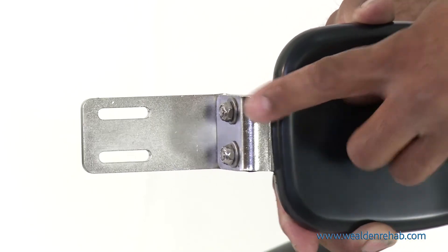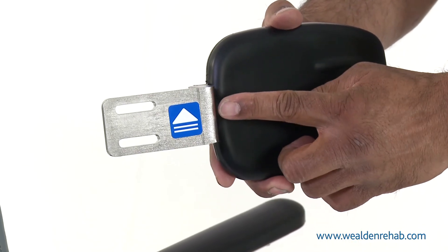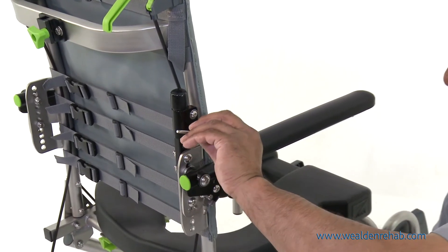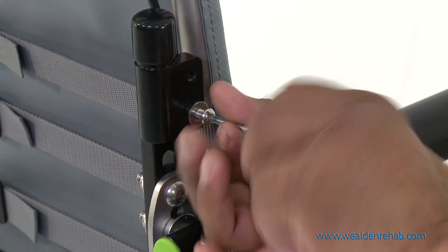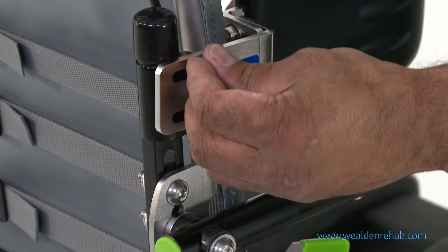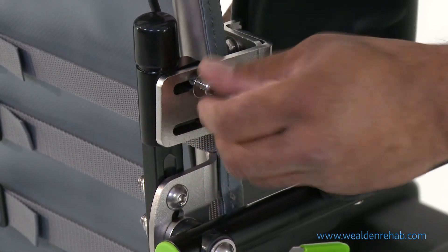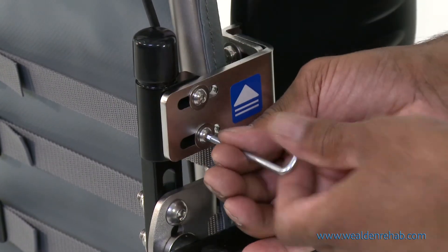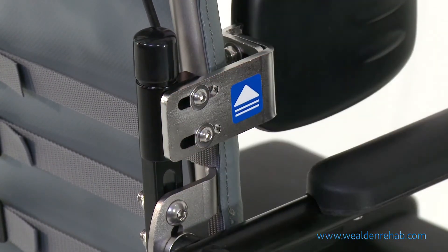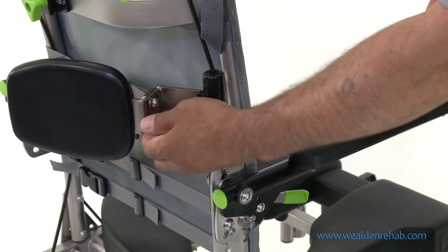Take the lateral support, ensuring that the blue arrow is on the outside and pointing upwards, and screw into place using the two screws and washers. The lateral support locks into place both in position and to the rear of the chair.